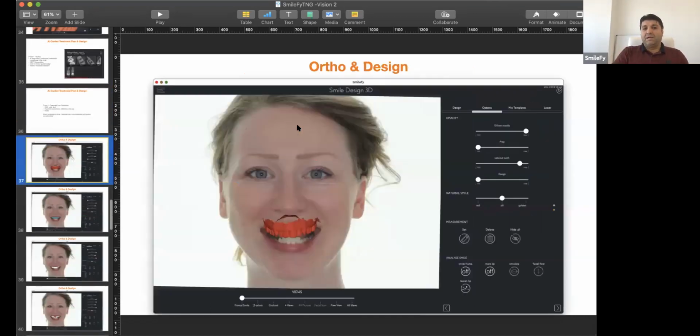Then also something that you can do, we have a test phase now with a company called ULab. ULab is a company that creates ortho plannings and aligners. You have the original intraoral scan. You have the latest model of the ortho sequence. Everything is digital, right? You didn't touch the patient right now. Everything is digitally planned and organized.